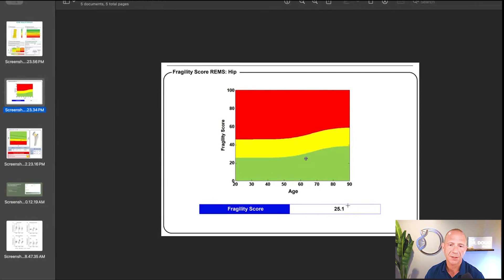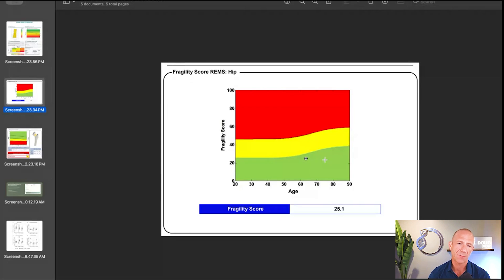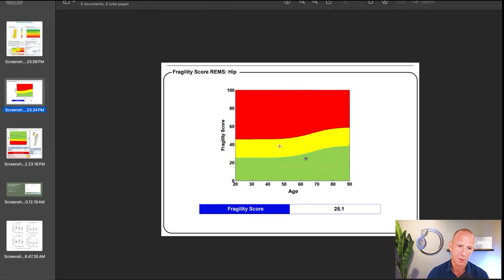On the next page we see the fragility score: 25.1 out of 100. There's a graph with age on the x-axis and fragility score on the y-axis, with a green, yellow, red color band — you want to stay in the green. Lower is better. A fragility score of 25.1 looks pretty good, and in conjunction with a T-score that also looks good, this is really promising from a prognostic perspective. Of course we compare this to all the other data we have.